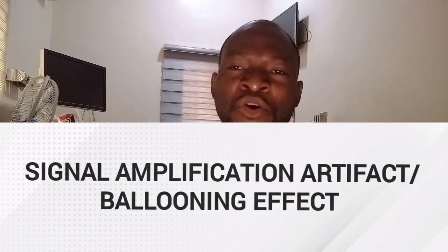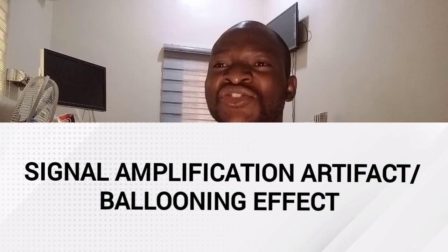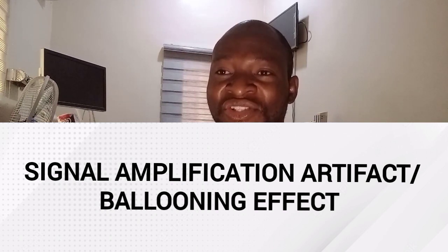Now, signal amplification artifacts, what you call ballooning effect. This signal can be amplified stronger than normal when a very large acoustic mismatch is present between two interfaces.